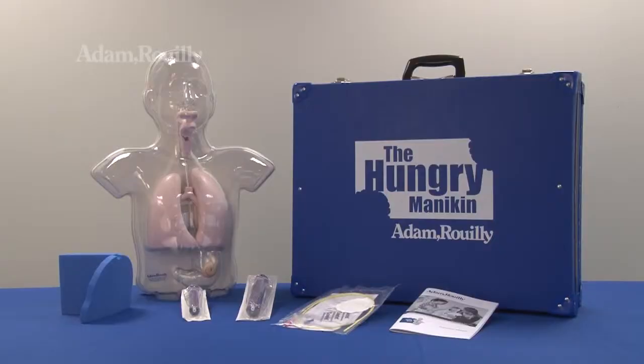The model features transparent anatomy to aid understanding, a movable epiglottis, a gastrostomy opening, and the removable stomach accepts liquids, feeds or medication.